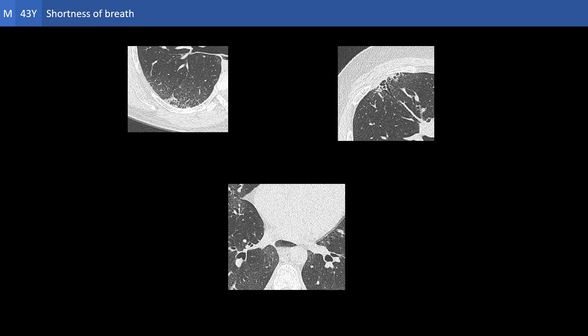Certain features are observed in this disease more frequently than in other entities of the interstitial lung disease spectrum. The first is the sectorial nature or distribution of the involvement, with relative sparing of the lung between the sectors. The bronchiectasis in this particular disease goes all the way down to the lung periphery and even merges with the honeycombing. The third feature is dilatation of the esophagus with formation of a gas-fluid level.